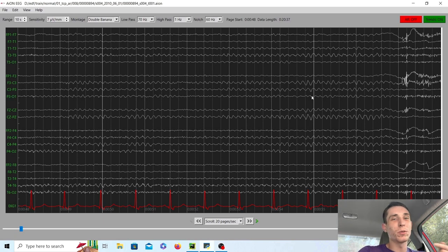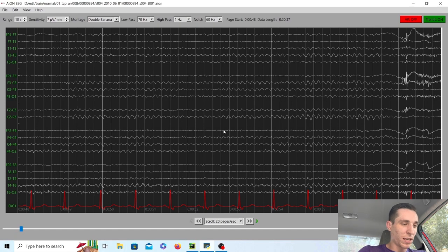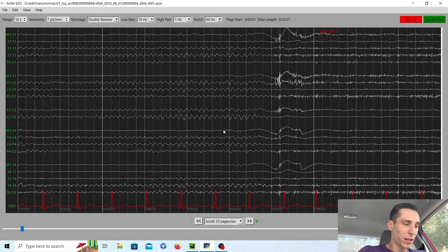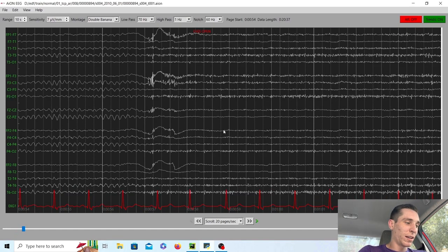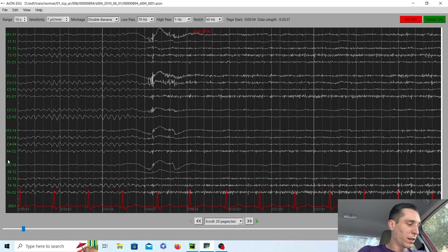So without further ado, let's get into the record. So the EEG was put on, it starts out here and the patient's eyes were closed here and they opened them right here. You can tell by this weird movement here in the frontal channels, FP1 and FP2.